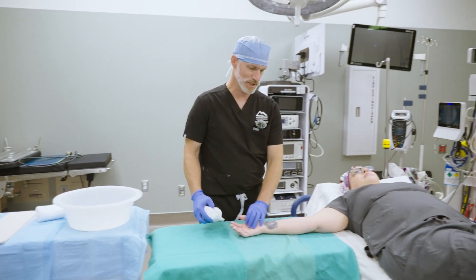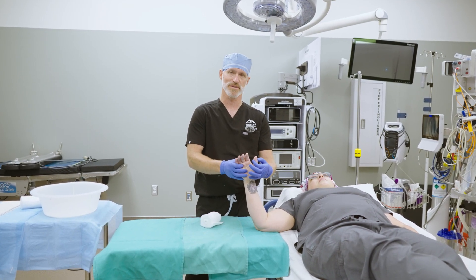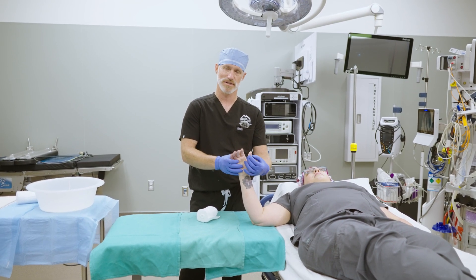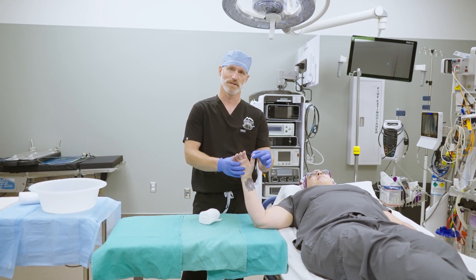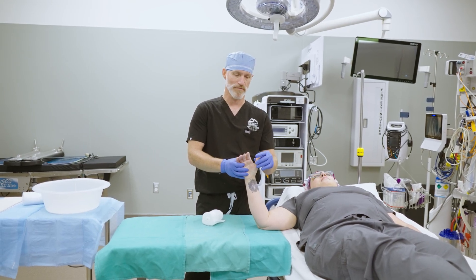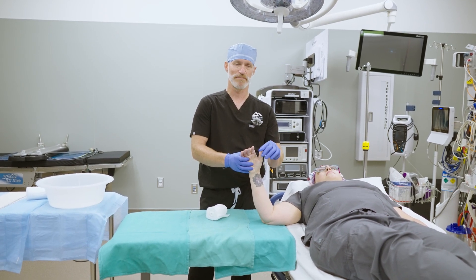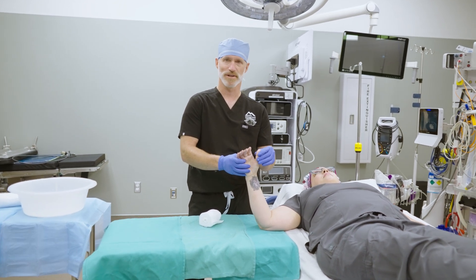For this splint, one thing to pay attention to: most of the time we will try and leave the very tip of the thumb out of the splint so the patient can move it and avoid stiffness at the joint. But sometimes if it's a tendon repair near the tip of the finger, we need to go all the way to the tip. We refer to that as IP free or IP in, meaning interphalangeal joint free or interphalangeal joint in the splint.